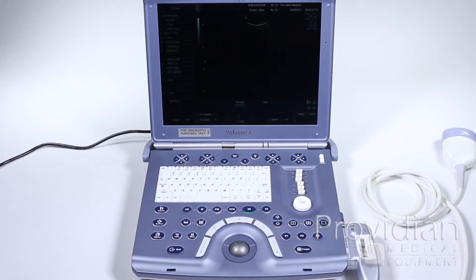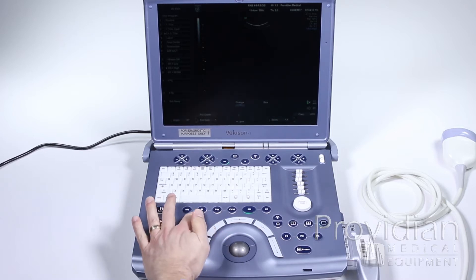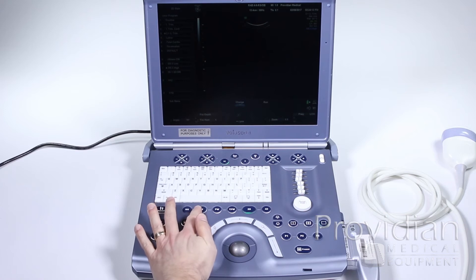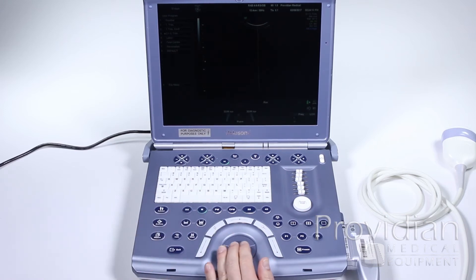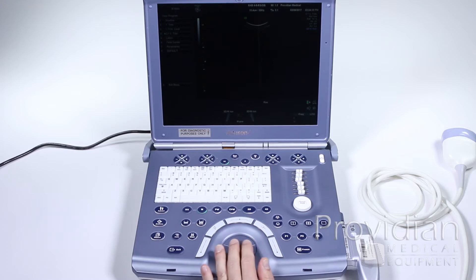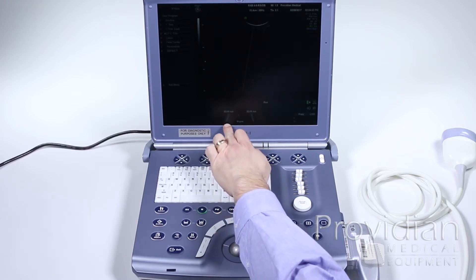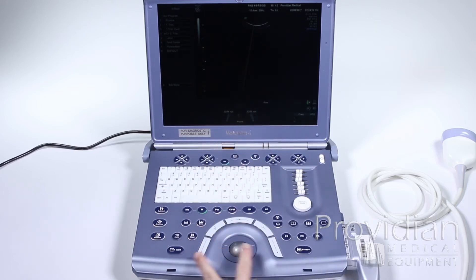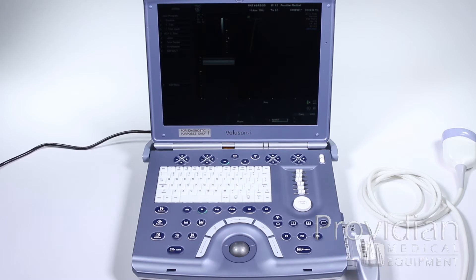To begin with Doppler and M mode, I'll first show M mode. All the mode keys are here, so we will press M for M mode. This gives us our M mode line, showing us where we want to position that line. You can have 2D M mode run, meaning these both do the same thing, so you'll press that and you'll get your split screen.